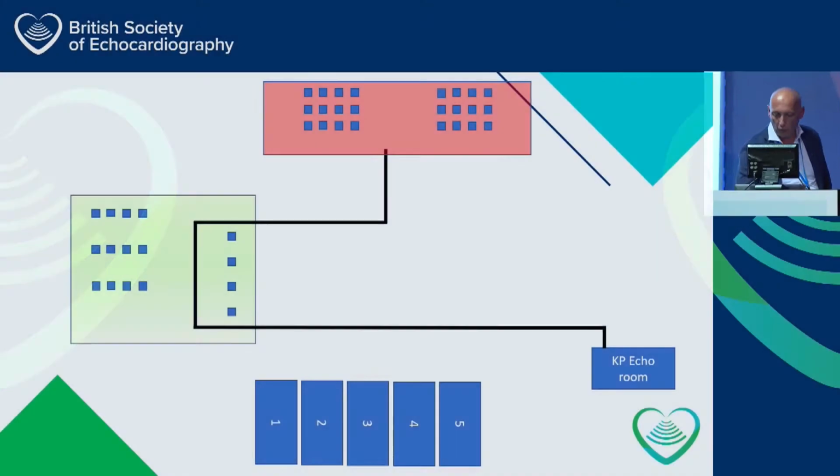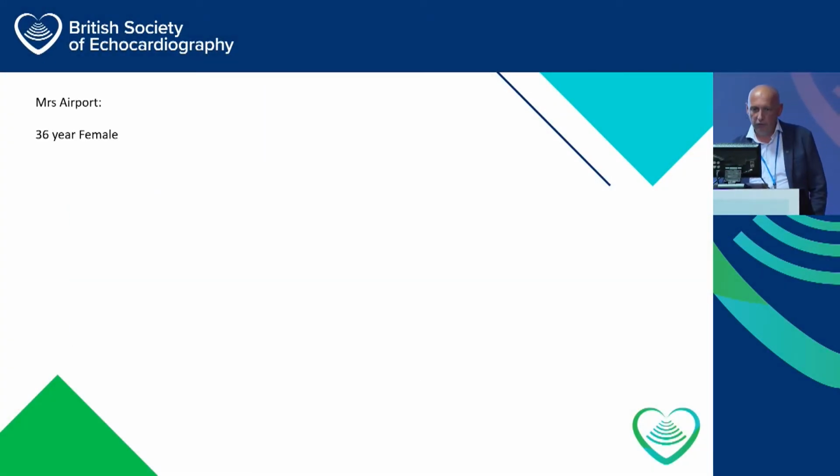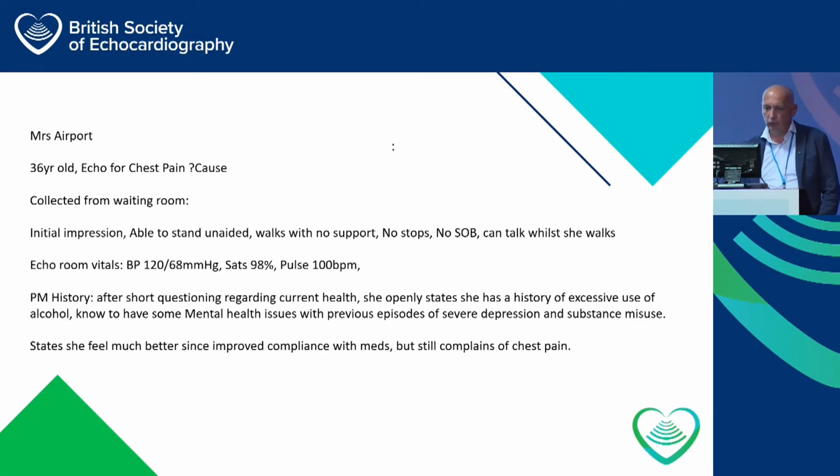So your echo should start when you go to the waiting room. And I'm all for echo support workers. I think they do a great job, absolutely. Streamline the service. But for me, the clinical examination starts then. So it starts the moment I go into that waiting room. So this is her, Mrs. Airport, a 36-year-old female who has come again for chest pain.